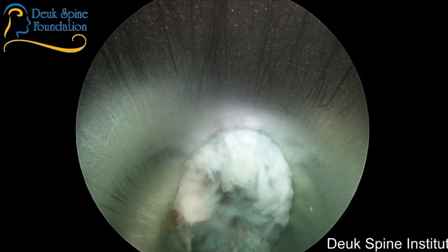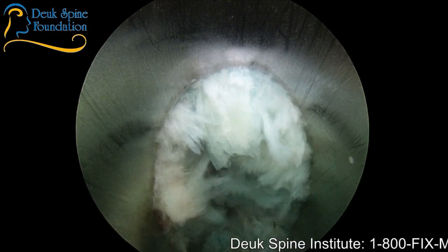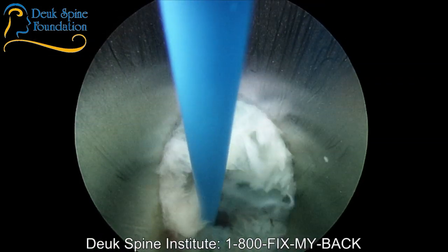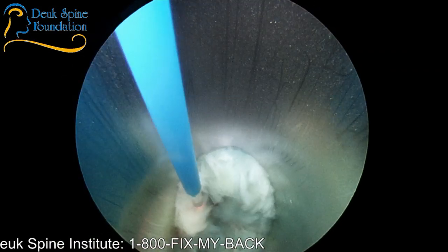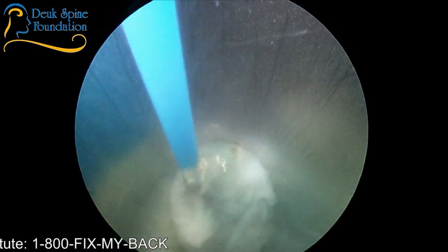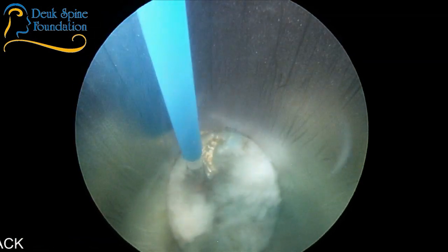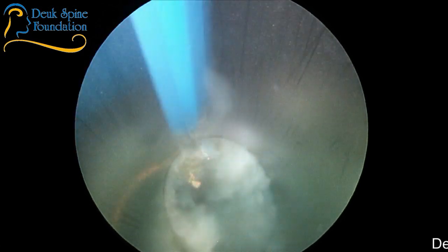All right, so we're inside the L3-4 disc. You can see that it has the typical appearance of a damaged disc. It's been injured with a tear, herniation, and some degeneration. And we're pretty deep in, and you can still see that there's a lot of scar tissue from the inflammation. See that scar tissue right there? That's a piece of herniation that's so scarred up, it's literally like a rock. It's concrete. It's got dystrophic calcification. It's got a lot of collagenization.